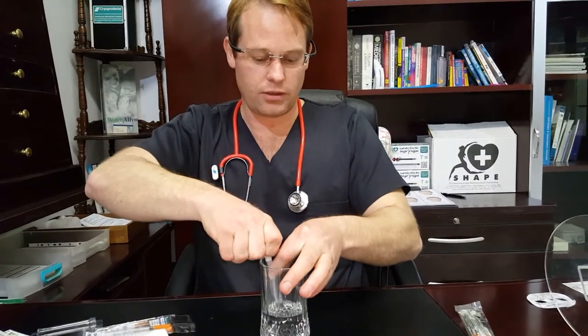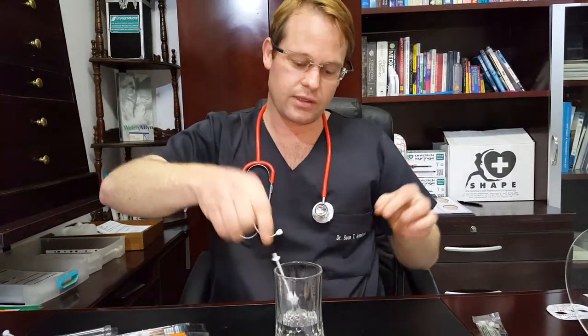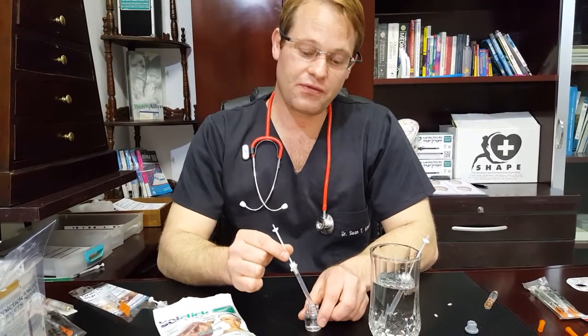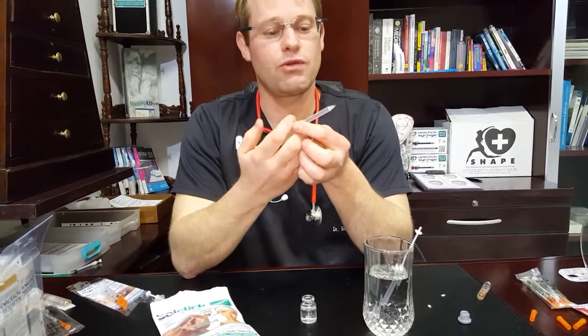You place it in there. You can draw back using your S-Tab and it will self-fill, as you can see. So we've filled our syringe to our required dosage. You see our little S-Tab — we simply twist that off and then we're ready to inject.